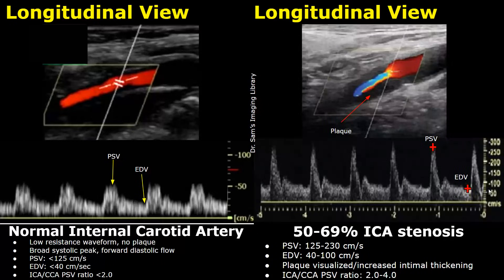In a 50 to 69% stenosis, the PSV will be between 125 to 230 cm per second and the EDV will be between 40 to 100 cm per second. The plaque will be visualized or increased intimal thickening will be seen, and the ICA to CCA PSV ratio will be between 2 to 4.